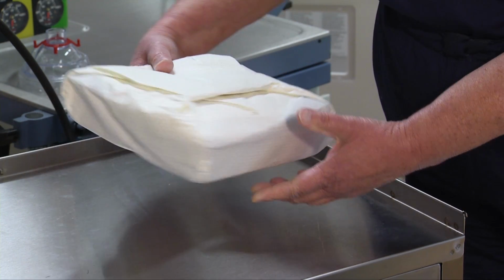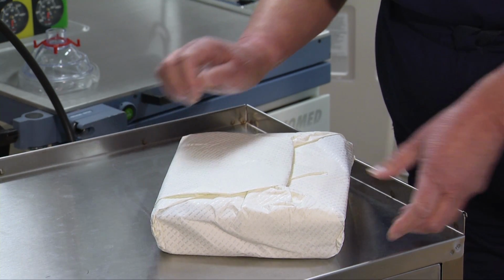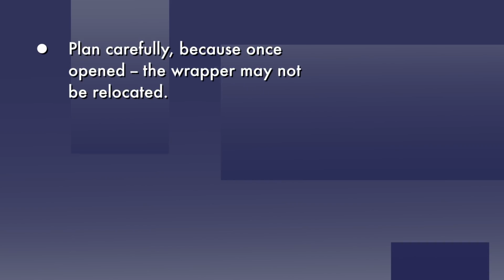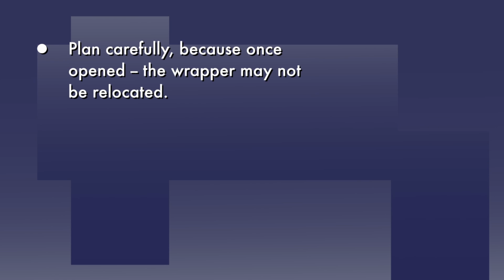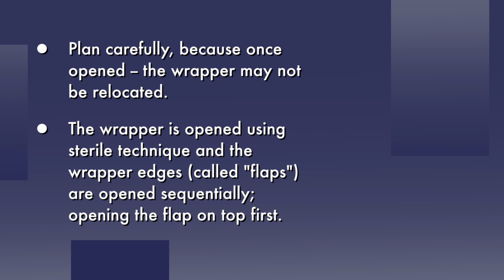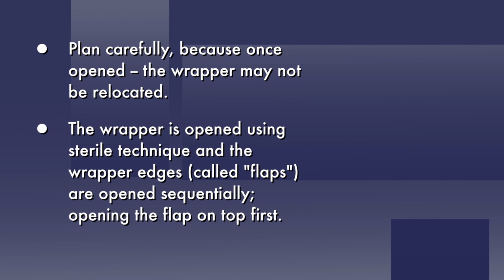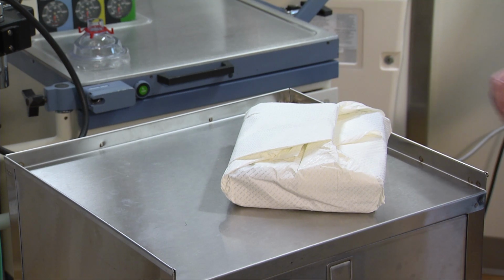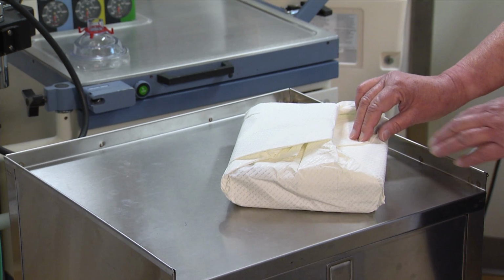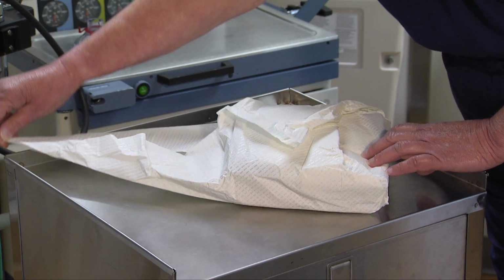Place the wrapped prep set at the right front corner of the prep stand at a diagonal with the top flap facing away from you. Plan carefully, because once opened, the wrapper may not be relocated. The wrapper is opened using sterile technique, and the wrapper edges, called flaps, are opened sequentially, opening the flap on top first. Grasp the corner of the first flap and open it away from you, touching only the corner and the 1 to 2 inch perimeter of the wrapper edge.